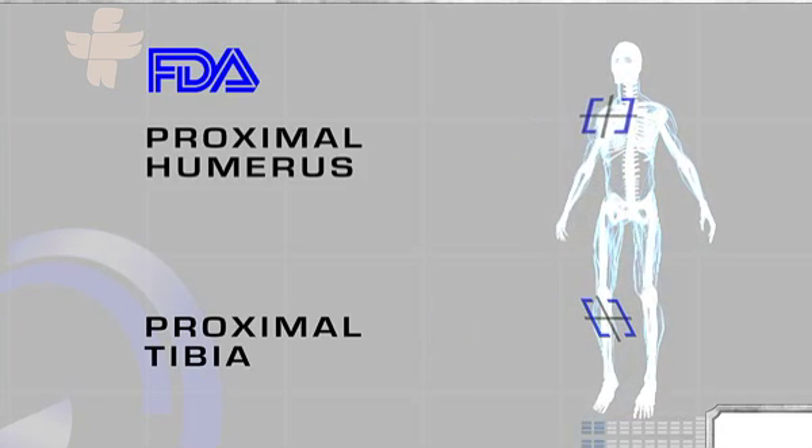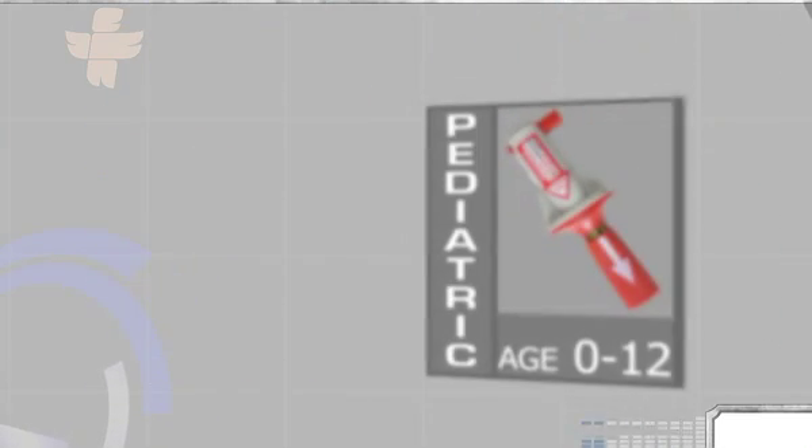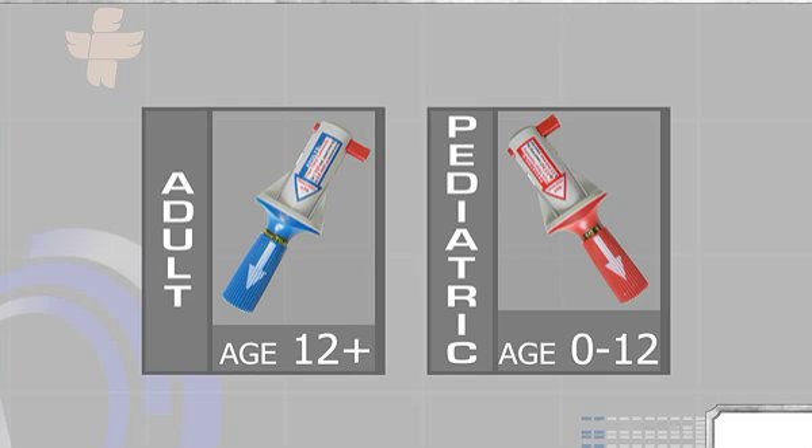The BIG is FDA approved for use in two major sites: the proximal tibia and the proximal humerus. The proximal humerus site can be used for adult patients only. Use the red pediatric BIG on term newborns to children 12 years of age. Use the blue adult BIG on patients 12 years of age and older.